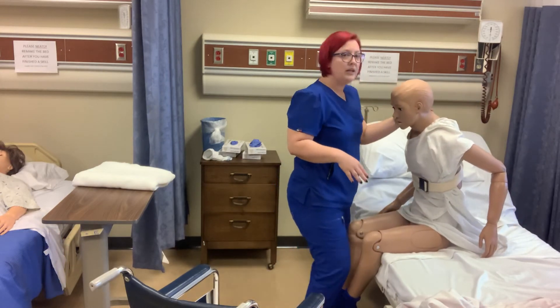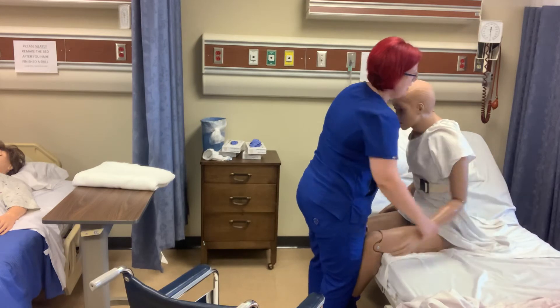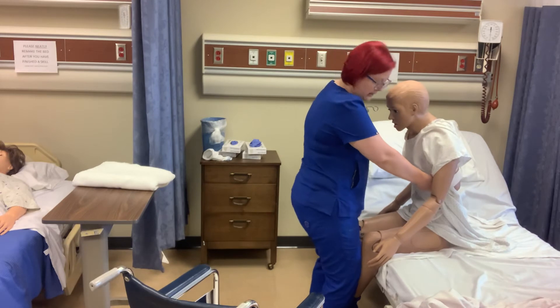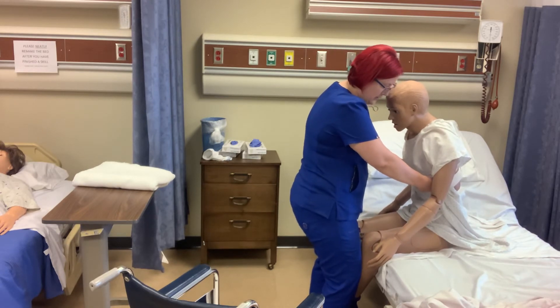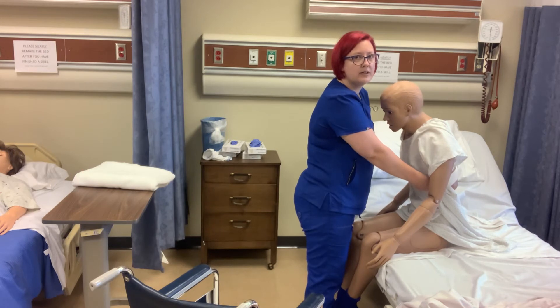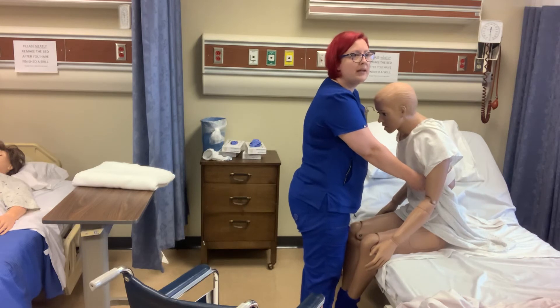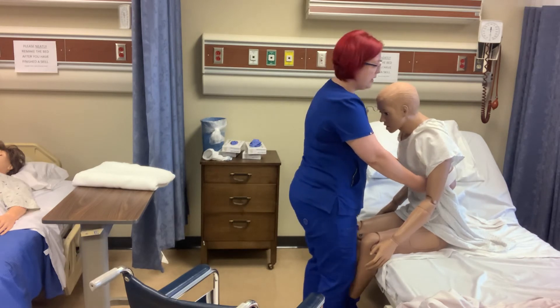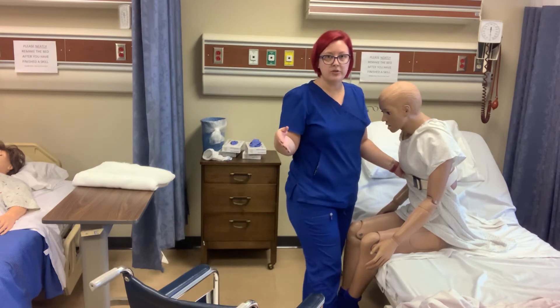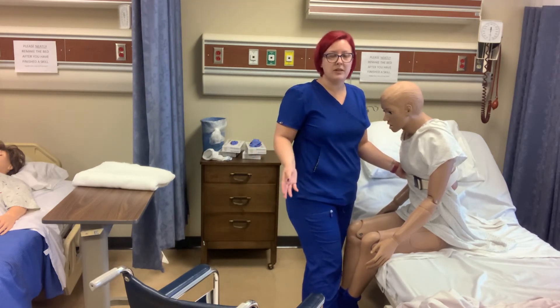Then you want to make sure that you're standing in front of the resident and you want to grasp the belt at the side. You want your knees to be near his knees to the side. Then we're going to tell our resident on the count of three, we're going to stand up. So we're going to use our hips and our knees — we're not going to use our back — and we're going to stand the resident up. On the count of three, we're going to stand up and then I'm going to pivot him into the wheelchair. He's going to reach back and help lower him into the chair.